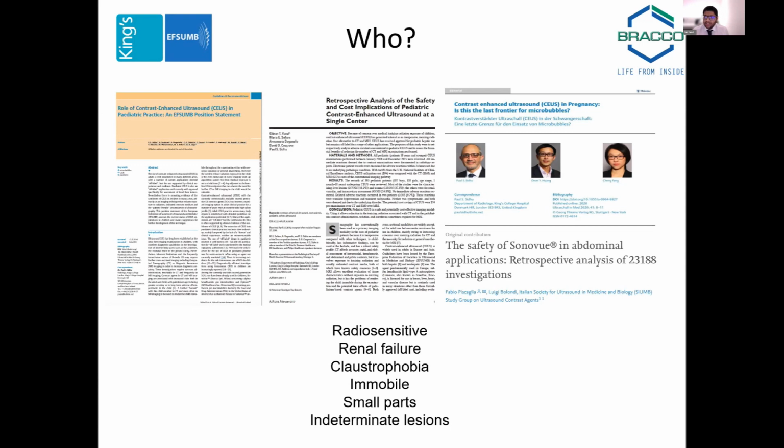I don't know if anyone has been into an MRI scanner or not, but it's certainly not the most pleasant experience in the world. It's very small, claustrophobic, loud. So you can understand how a patient wouldn't like it. And you are not there for a couple of minutes. You are there for potentially an hour or more.